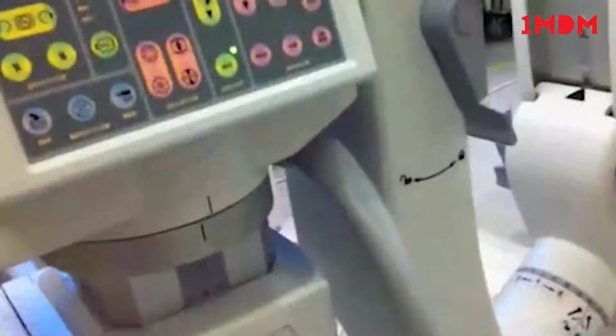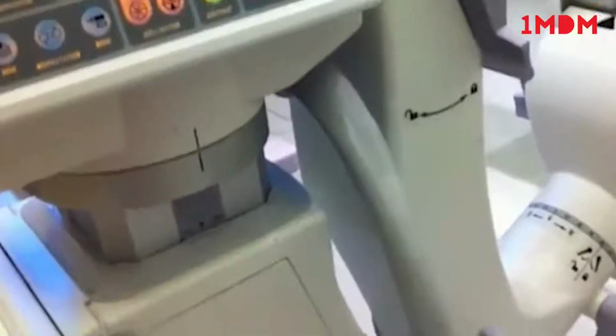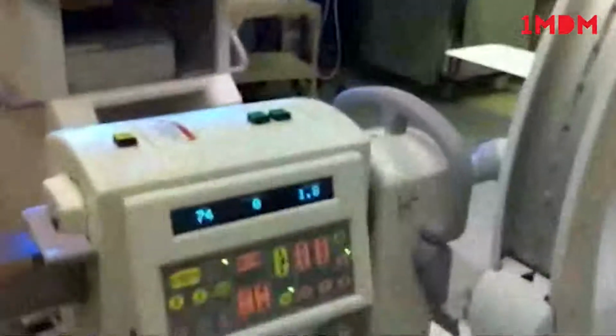All right. This is typically useful for lateral alignment, say for instance a C-spine or an L-spine. When you're doing those kinds of surgeries, if the patient's not properly positioned for the lateral, you're going to see the end plate, and of course you want to wigwag to try to avoid that. There is a special function on this particular C-arm.